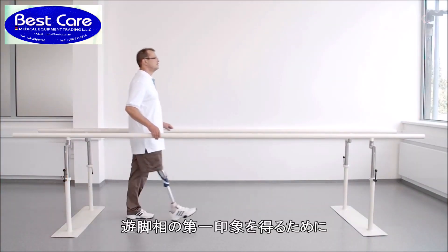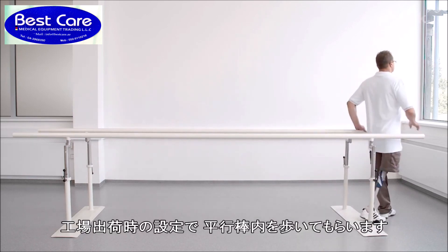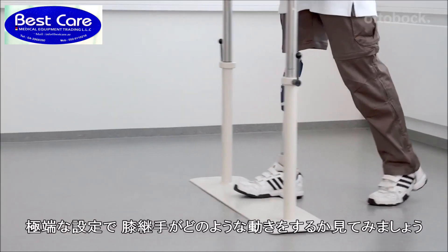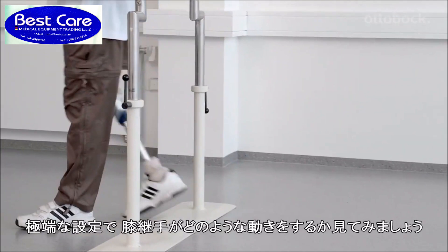To get a first impression of the knee joint swing phase control, have the patient walk in the parallel bars with the factory settings. The following video sequence will demonstrate how the knee joint reacts to the extreme settings of the swing phase damping.